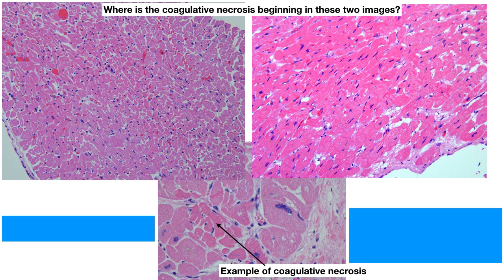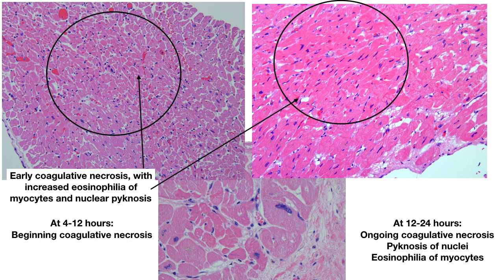On this slide, where is the coagulative necrosis beginning in these two images? There's early coagulative necrosis — you can see roughly where the areas are circled. You can see hyper-eosinophilia of the cardiac myocytes and some pyknosis or shrinkage of the nuclei. At the bottom, it shows an example of fairly well-developed coagulative necrosis. At 4 to 12 hours, you see beginning of coagulative necrosis, and at 12 to 24 hours, you see ongoing coagulative necrosis, pyknosis of nuclei, and eosinophilia of myocytes.